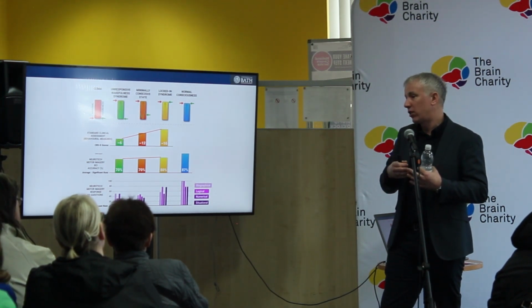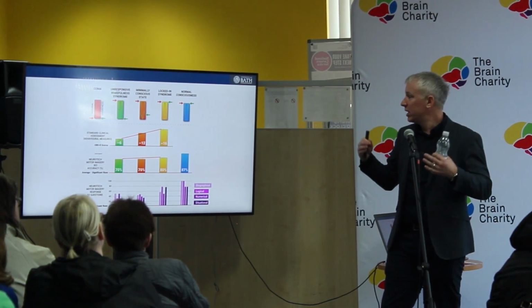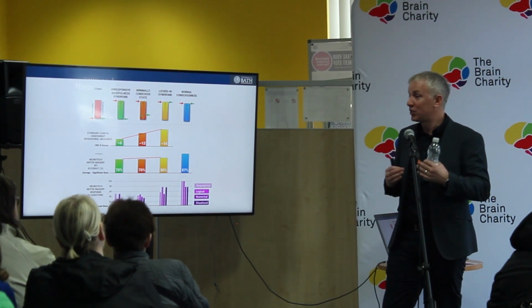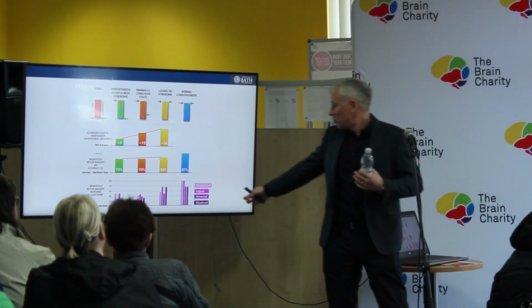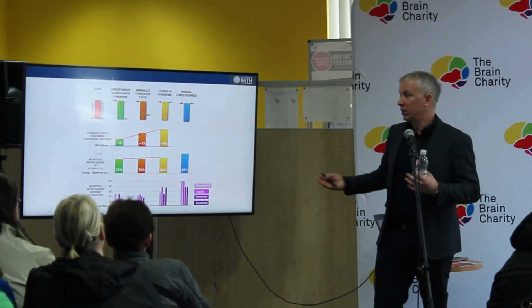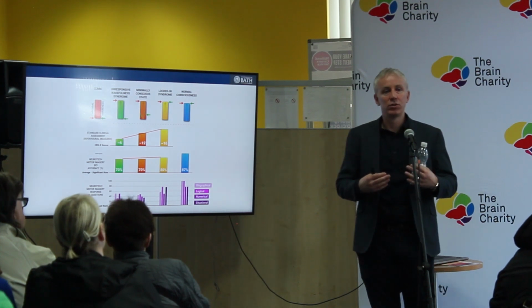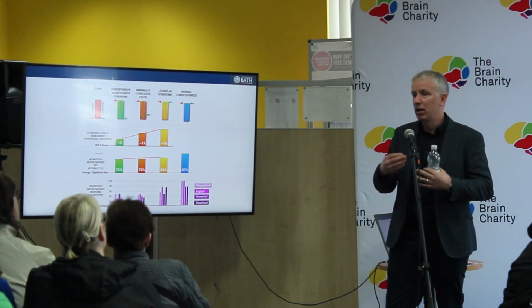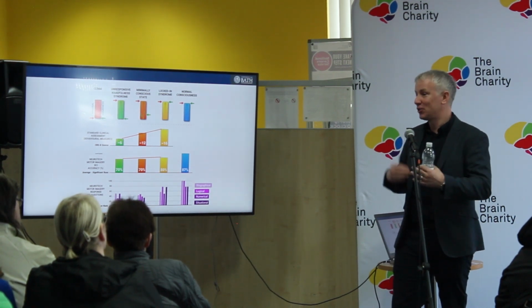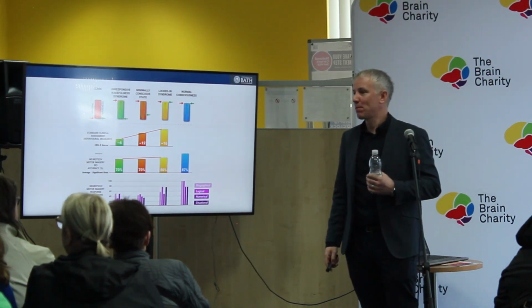And so what we're seeing is that our results in terms of the brain-computer interface are correlated with the level of severity, but less so than the standard clinical tests. So brain-computer interfaces are definitely adding value. We couldn't say that we can definitely enable somebody to communicate with this technology just yet. We're just assessing whether a person was able to respond more reliably to the biographical questions versus the logical questions and so on, just to see if there's a profile there that we can determine. Sorry, go ahead.